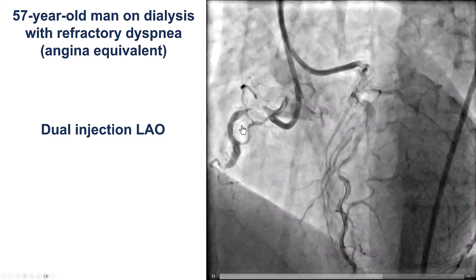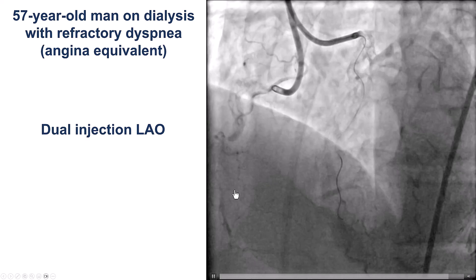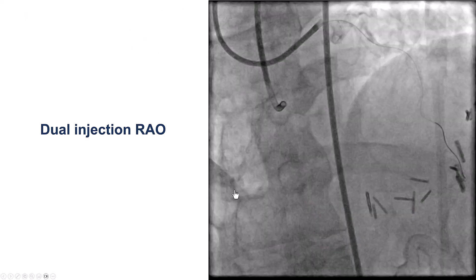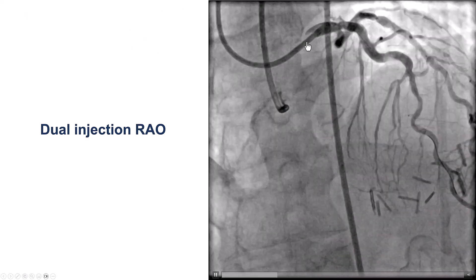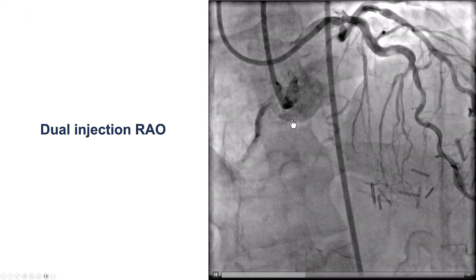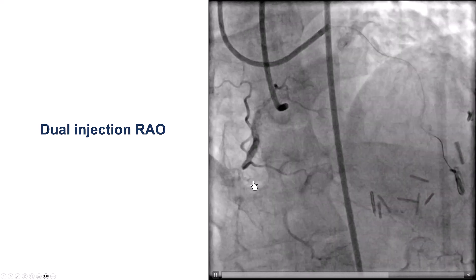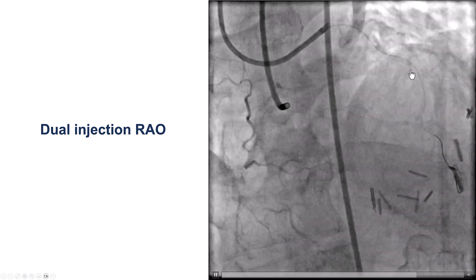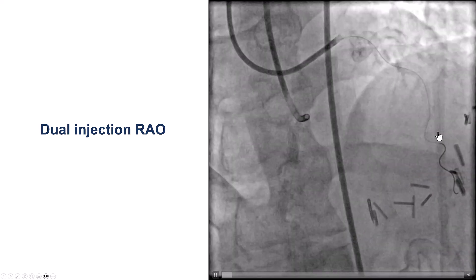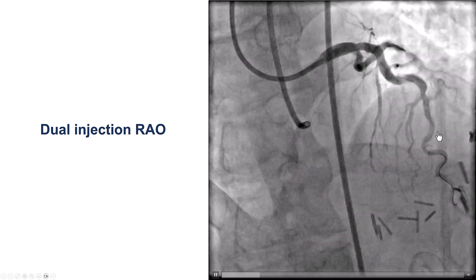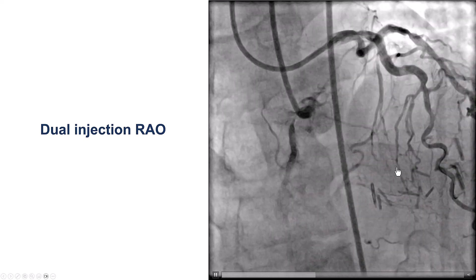The right coronary artery was heavily calcified and occluded on the middle segment. This is the dual injection. There is a CTO with clear proximal cap, short length. There are some septal collaterals filling the right coronary artery from the LAD.